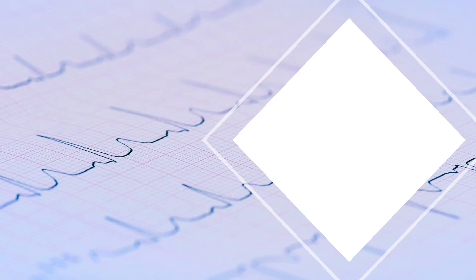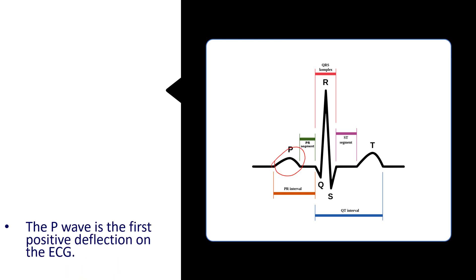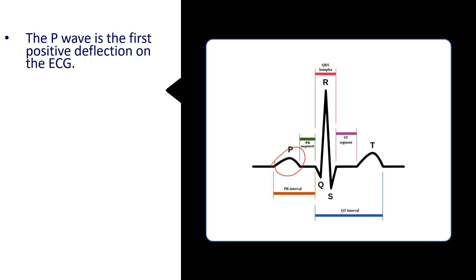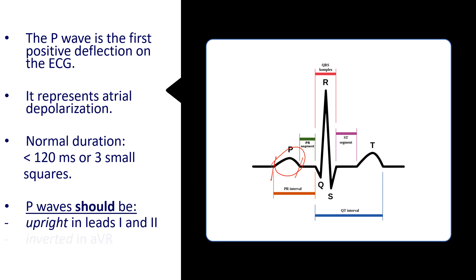Our tip for this time is going to be about the P waves. The P wave is this first positive deflection in the ECG. It represents atrial depolarization and the normal duration from the beginning till the end is about three small squares, so less than 120 milliseconds. The P waves should be upright in leads 1 and 2 and inverted in AVR.